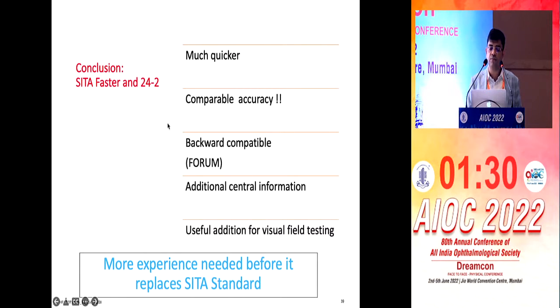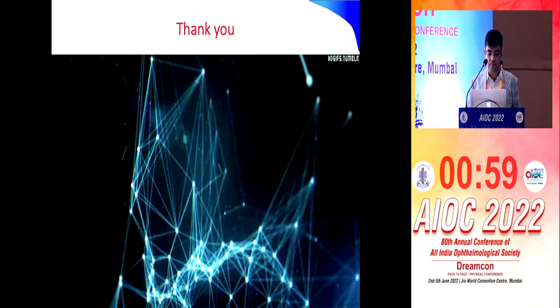So to conclude, I'll say definitely the biggest advantage here is it's much, much quicker. That is the biggest advantage which both SITA Faster and 24-2C is giving. Accuracy is comparable. At the cost of time, you may have some variability in detection, but accuracy is comparable. If you have the Forum software, definitely it has got good compatibility. And overall, it's a useful addition, but I believe still there is not consensus among all the glaucoma experts about how useful they are. As we use it more and we get more experience, it may be an alternative to a SITA standard. Thank you so much.